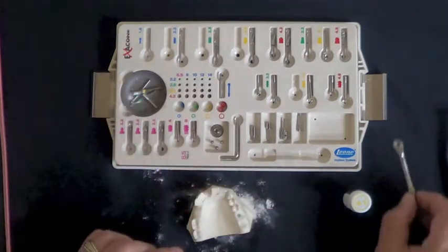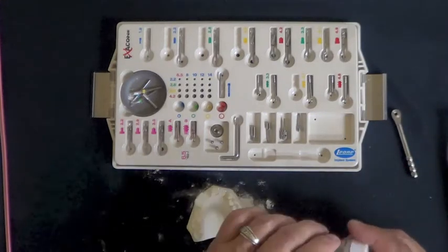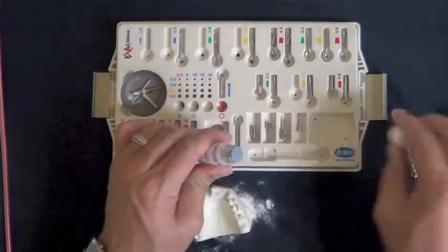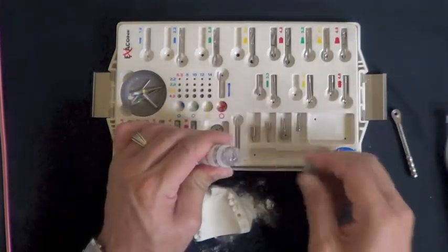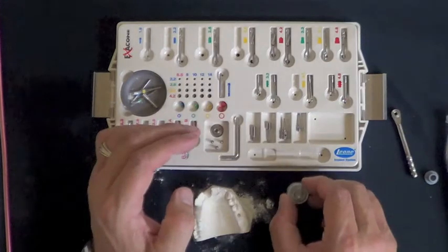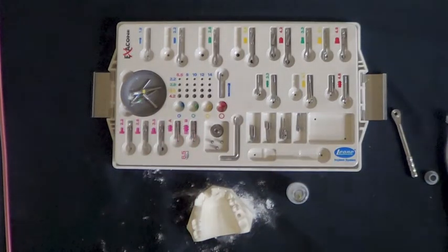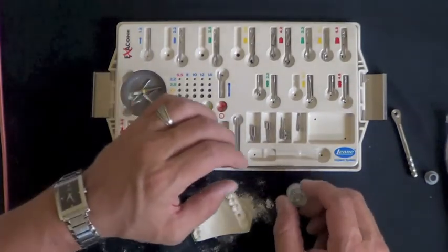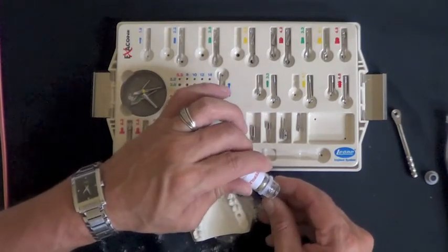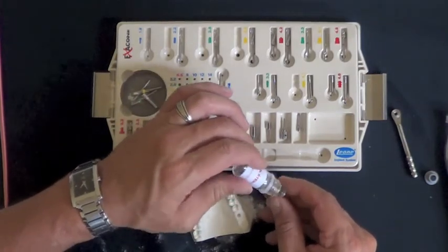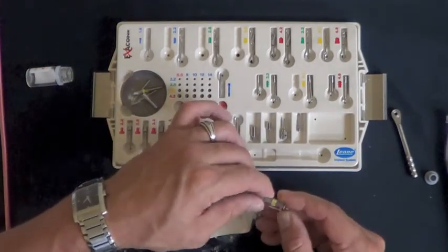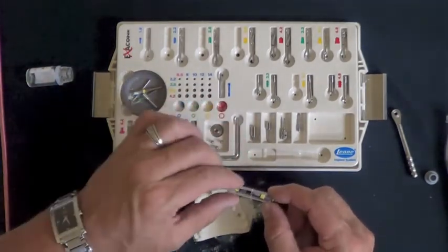All right, so we've done our osteotomy, we've tapped or threaded the site, and the next step then would be to take the implant, remove it from the packaging, reduce the rotation of the motor down to around 25 RPMs. Decide how you're going to place the implant, and the implant can be placed in several ways.